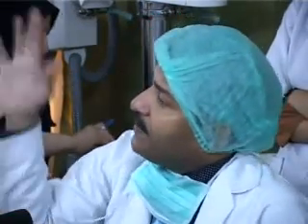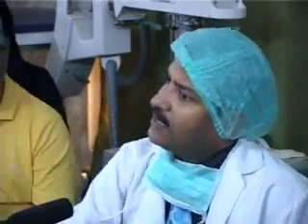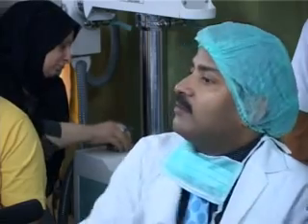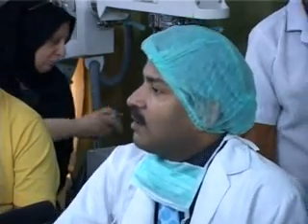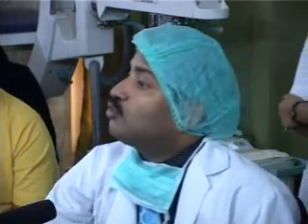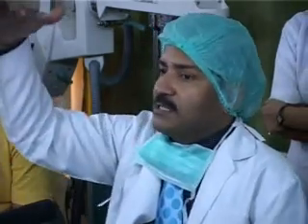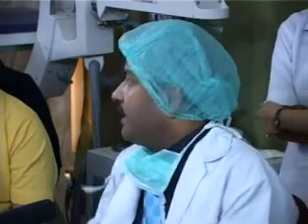But no matter how big the patient is, she will never accommodate more than 6 liters. And in an adult patient, no matter how small, even 4 feet in height, a minimum of 1.5 liters is required. This is the total amount of gas used to achieve a preset pressure of 12. Now if the preset pressure is, suppose, 18, then this will shift. If you want to get 18, then the minimum amount will be approximately 2 to 3 liters and the maximum will go up to 8 liters. Because if you increase the preset pressure, then more gas can be compressed there, isn't it? And the total amount of gas used will be more.